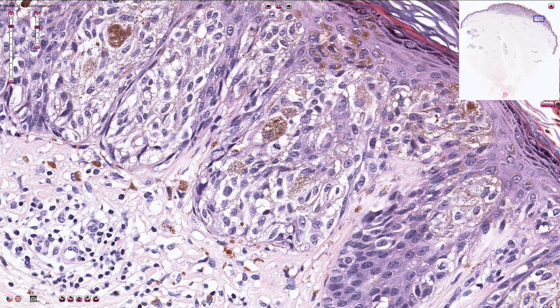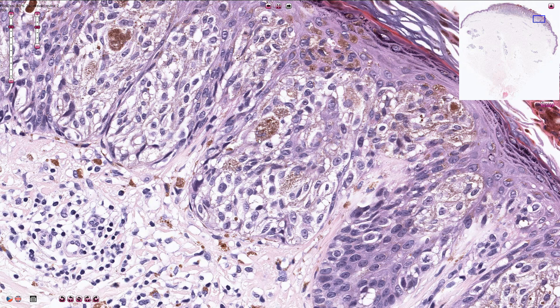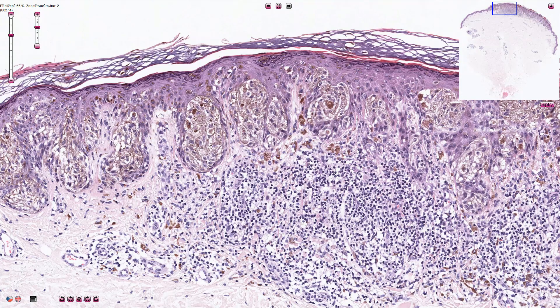The melanocytes are relatively large, the nuclei are not uniform, and here we have an ugly mitotic figure, and here we have another one. In this part of the picture, some of the melanocytes are actually located inside the dermis, so this is no longer superficial spreading melanoma in situ — this is invasive superficial spreading melanoma.